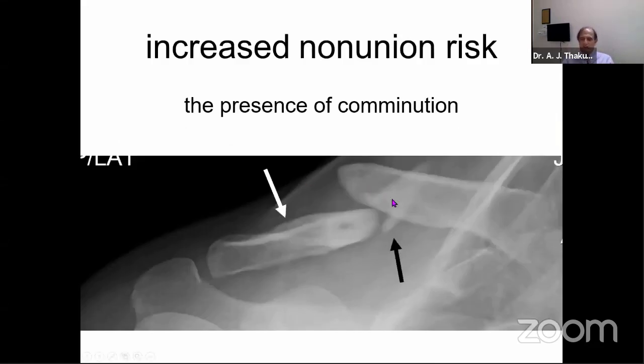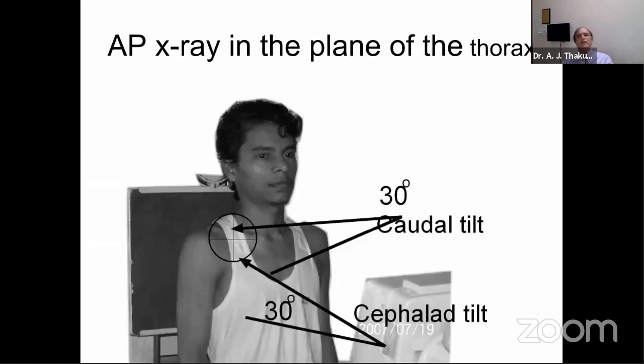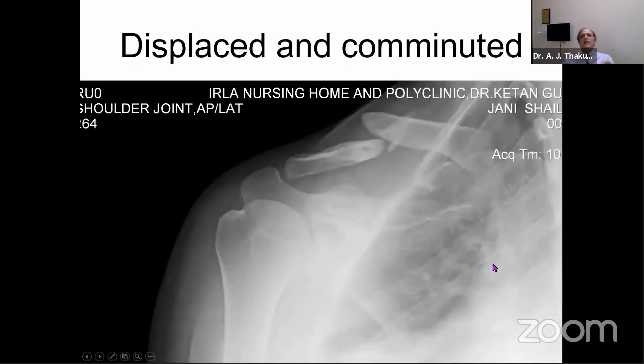Displaced clavicles need fixation because many times the skin is threatened by this spike, and if we treat it conservatively, there is ugly deformity, there is a shortening, and shortening gives a reduced strength in that joint. If it is bilateral, it could be really bad. So for that, we take AP X-rays in two planes, a caudal tilt and a cephalic tilt. That gives us a clear idea what is happening.